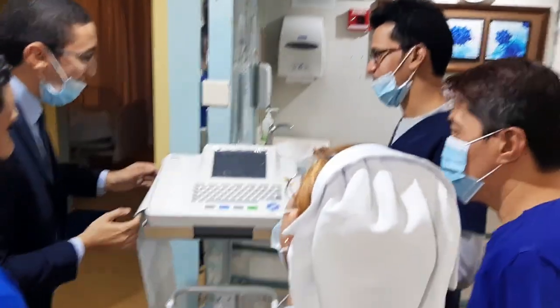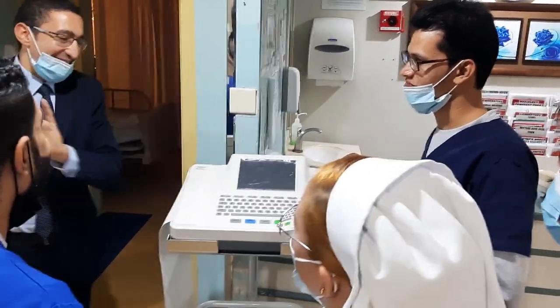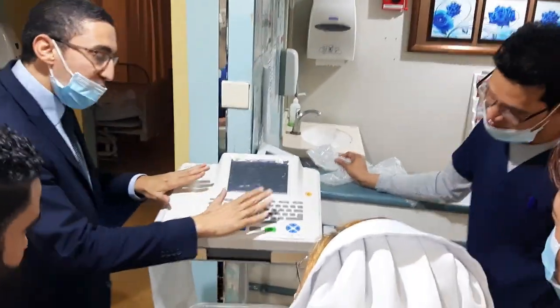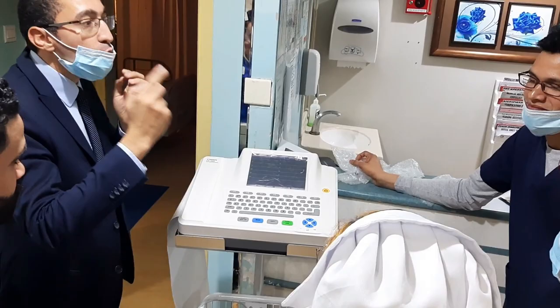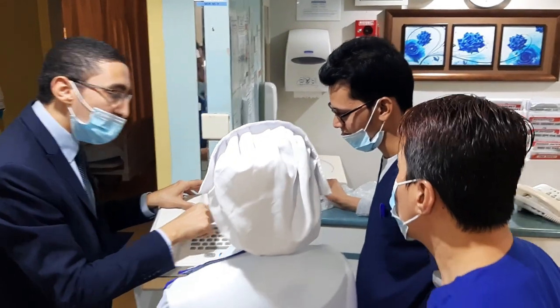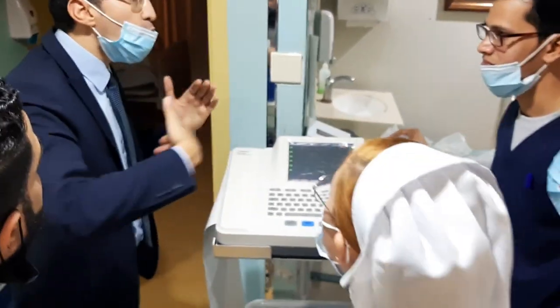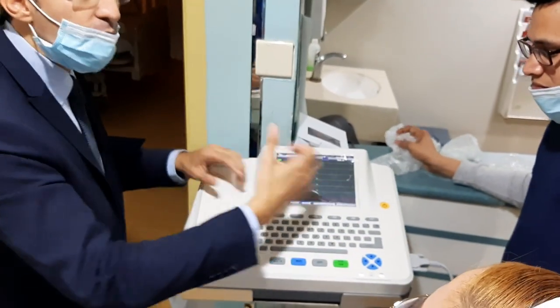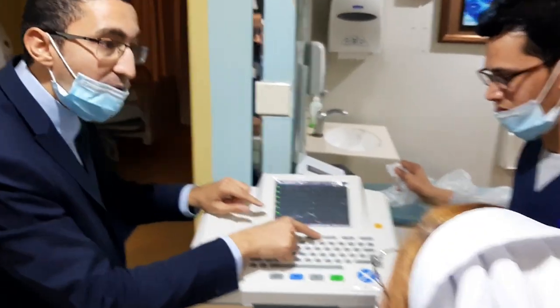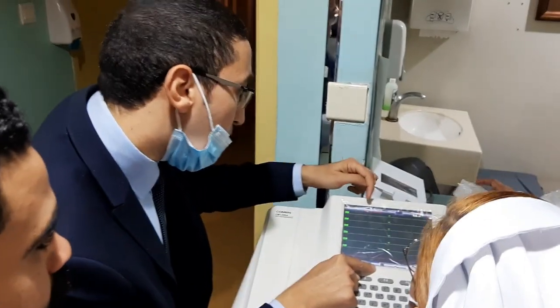Imagine that ECG is 1980s. All of you don't like this one. Here also you have the mode for this one. We speak about automatic. You have another mode for manual. What does manual mean? You have auto here, you have manual here. For doctors, especially for cardiology, maybe he needs a long strip, not only for one, for many. So how to record? You will record not by F5. So I record manual here, and it's written here.